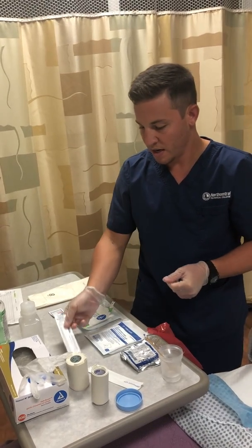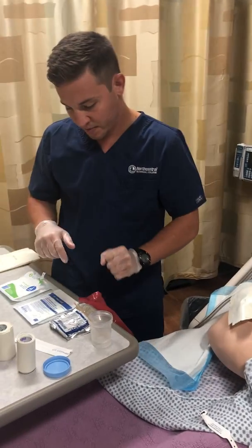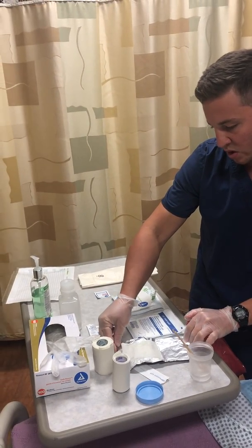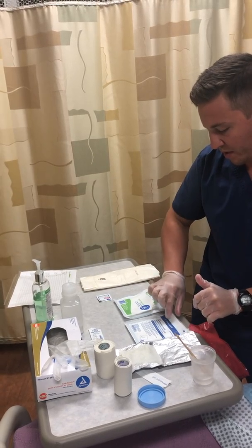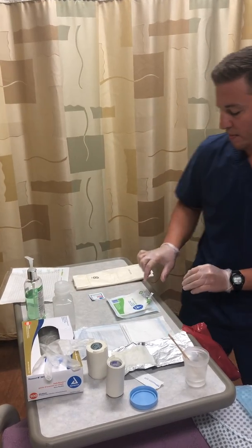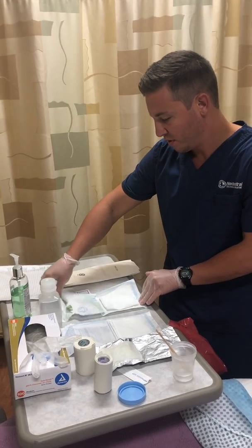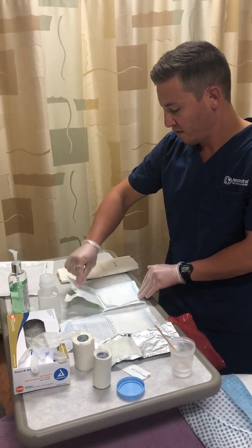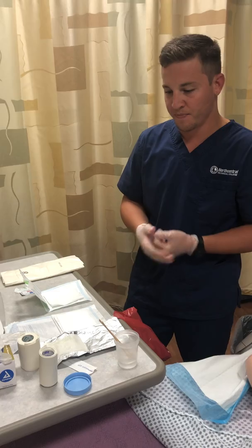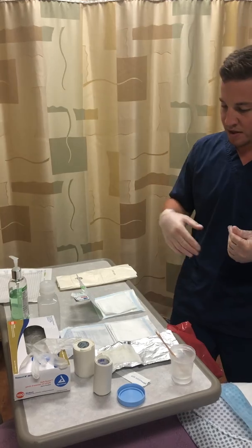I have my patient comfortable in a semi-Fowler's position here. So I'm also going to prep my area. Here I have my Vaseline gauze. I've got my drain sponges, my slitted drain sponges, and then I have my 4x4 here that we'll be using. My 4x4 gauze will go on top, my sterile gloves as well. I also have a biohazard bag set up. I have my foam tape that I'll be applying. Obviously gloves and hand sanitizer.